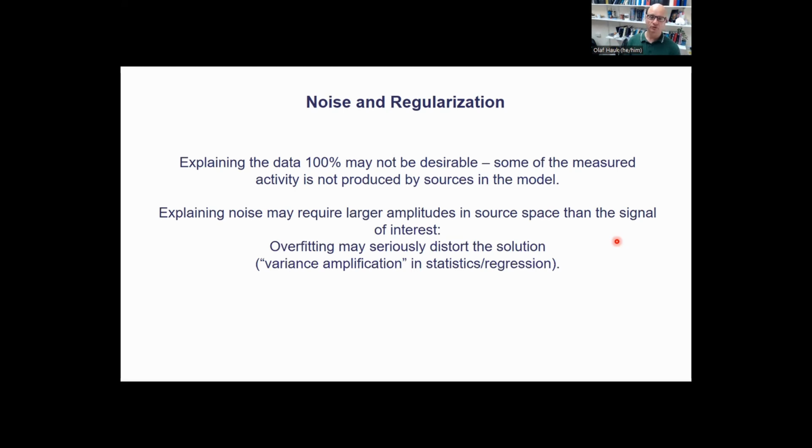by amplifying the noise. If you are familiar with variance amplification statistics or multiple linear regression, it is basically the same issue there. If you have highly correlated variables and noise in your data, then you may have to apply appropriate regularization methods.